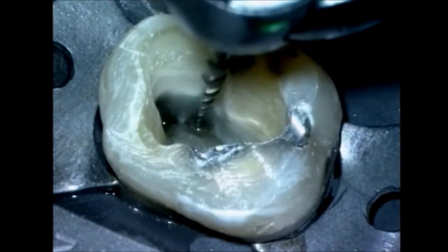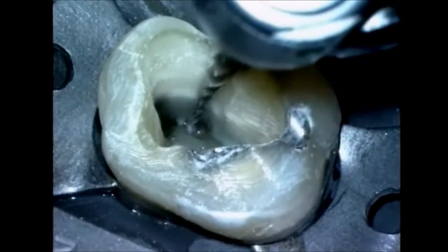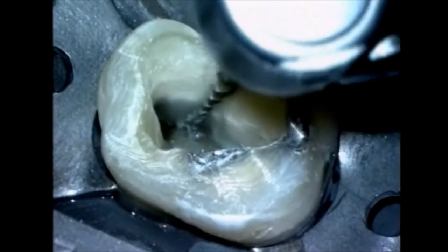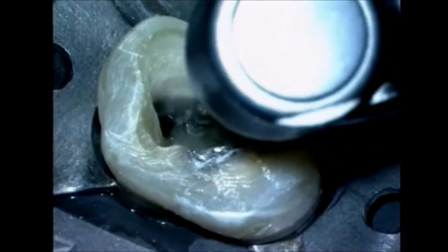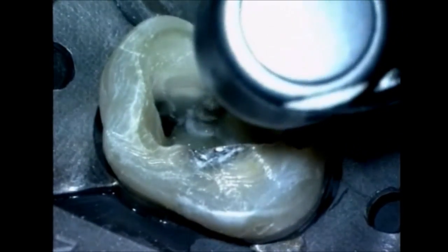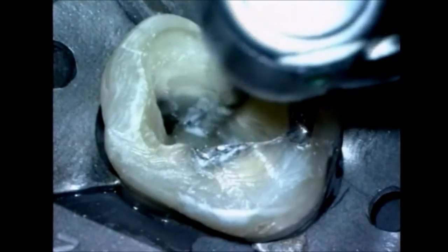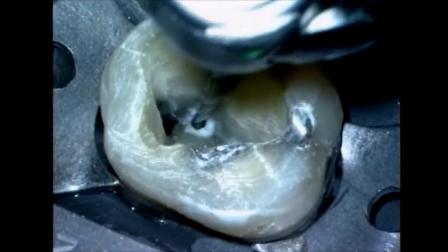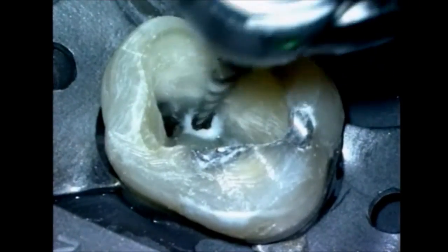Shaper X is passively fed into the canal until it encounters light resistance, then withdrawn 1 to 2 millimeters so it is loose within the canal and used to cut dentin on the outstroke. Shaper X is used like a brush to expand the shape and to improve straight line radicular access. When the desired shape has been achieved in the more coronal portion of the expanding preparation, then Shaper X may be passively fed a little deeper into the canal until it again encounters light resistance.